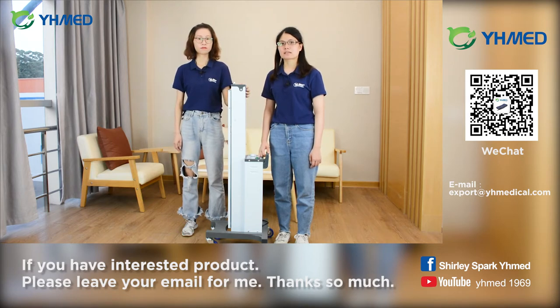It can kill the virus effectively. Suitable for indoor disinfection and sterilization to ensure health and safety of the environment.